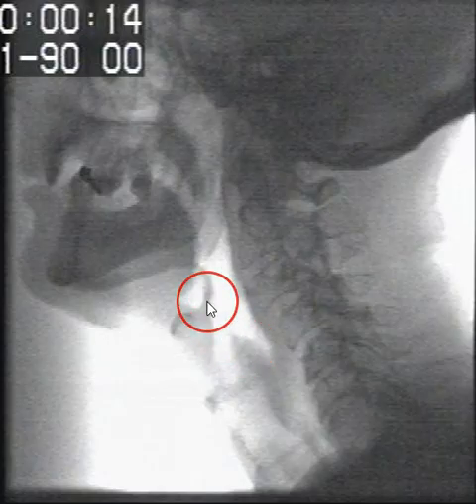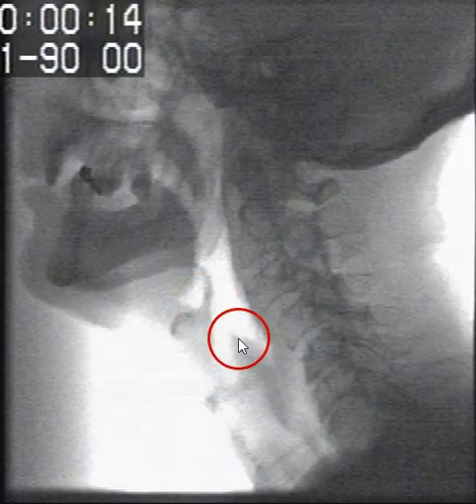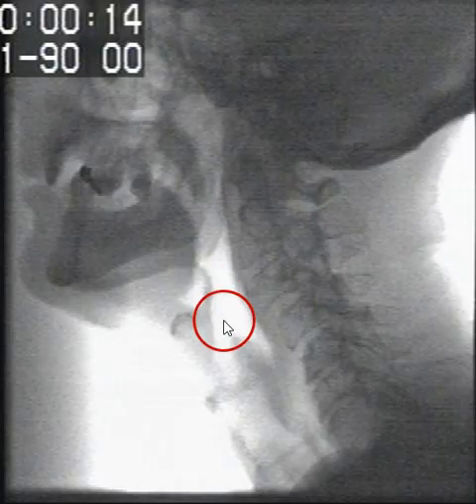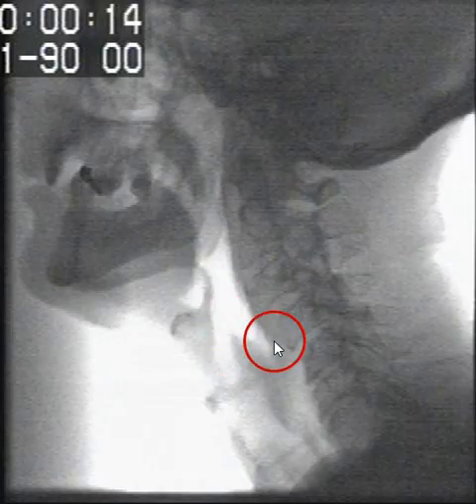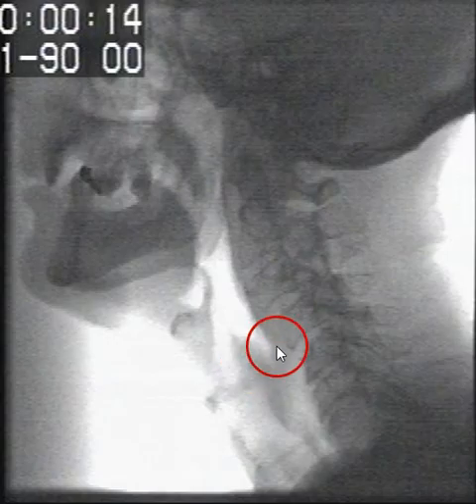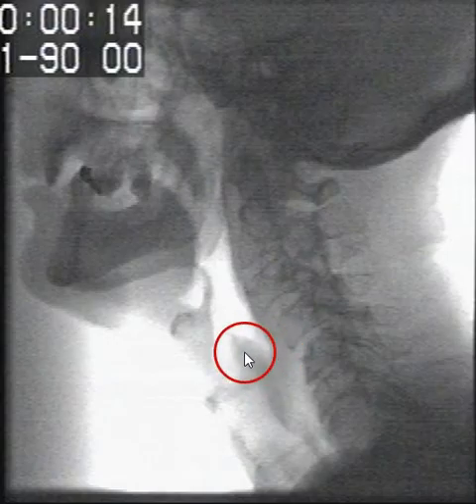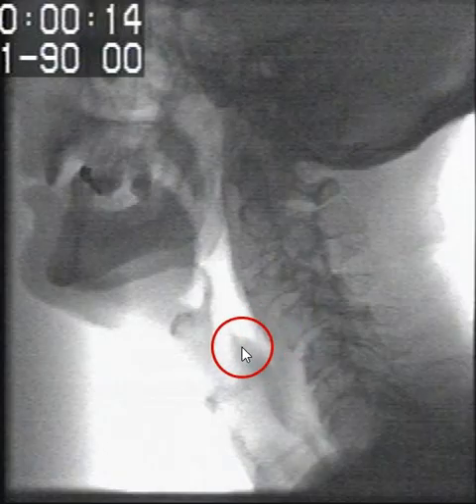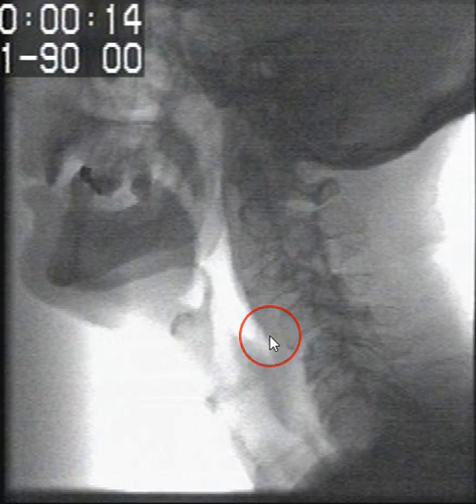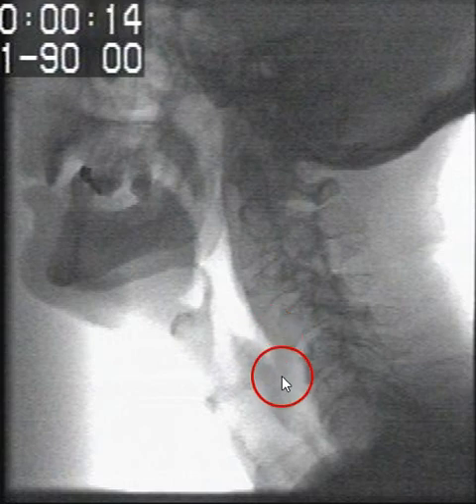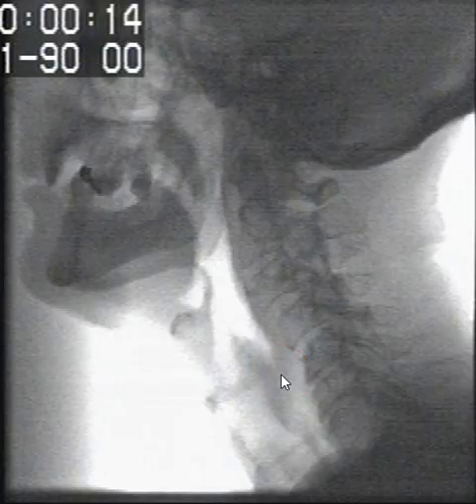Moving back up, we can in some cases see a structure which connects the arytenoid cartilage to the epiglottis, and this is called the aryepiglottic fold. In this region you have the piriform sinuses on either side. These can really only be visualized when they are filled with barium on video fluoroscopy.